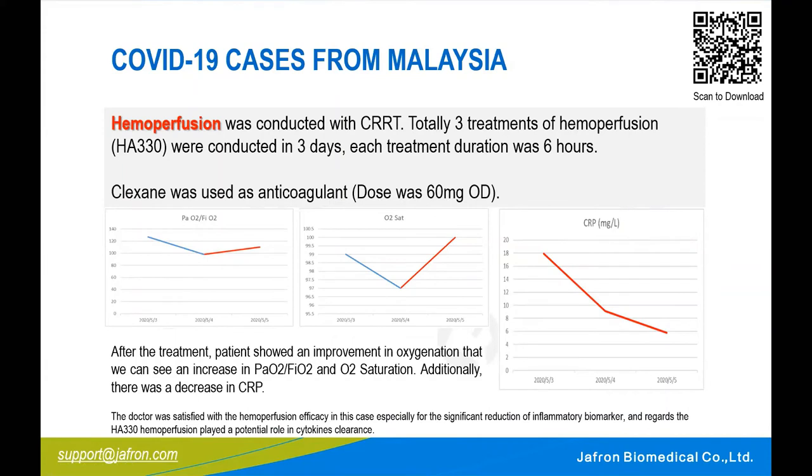And the doctor commented that he was very satisfied with this hemoperfusion efficacy. In this case, there is a significant reduction of the inflammatory markers, and then the patient was able to have a better clinical improvement.